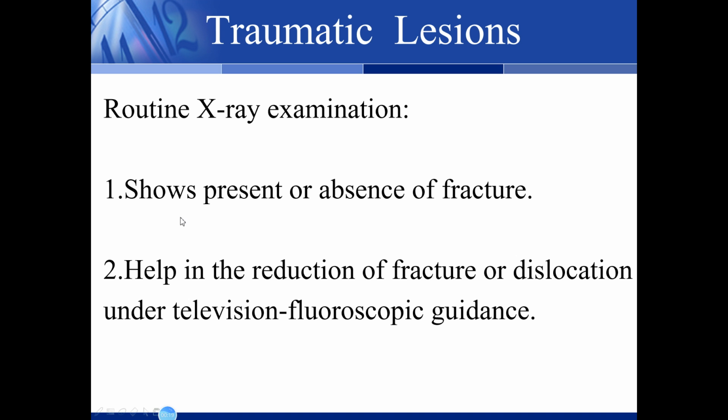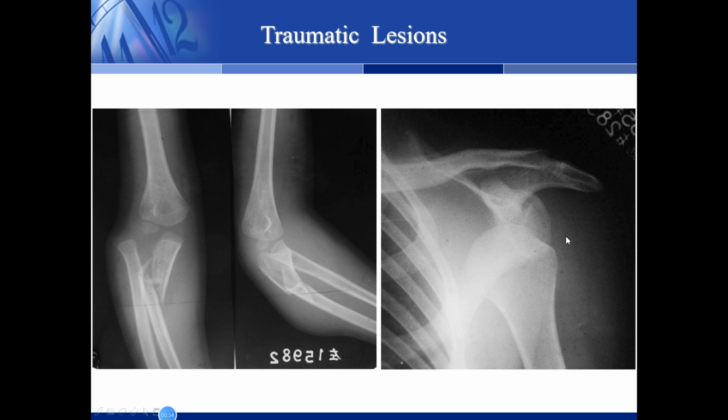First, it shows the presence or absence of the fracture, and it helps in the reduction of fracture or dislocation under television fluoroscopy guidance.